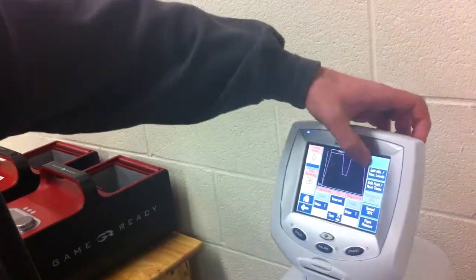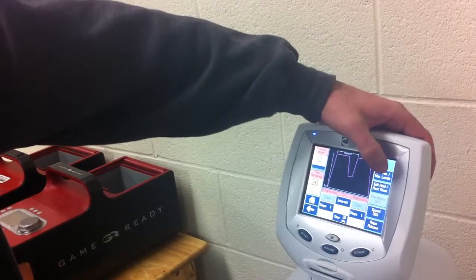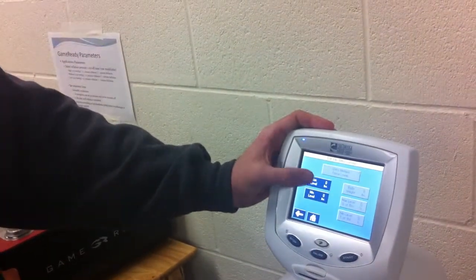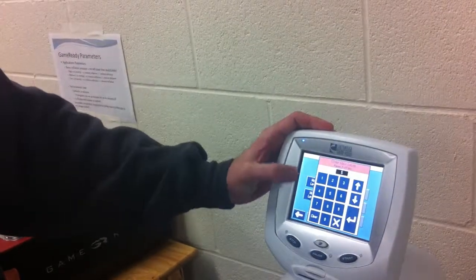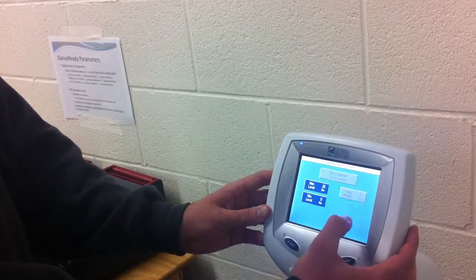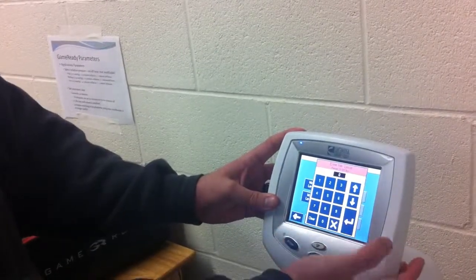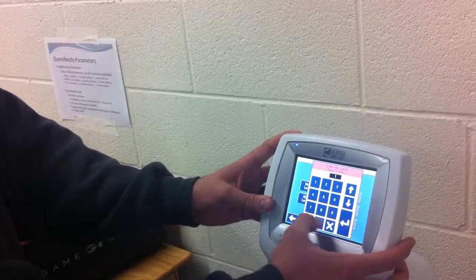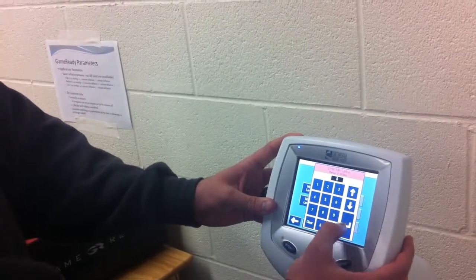Once we get there, we can come up to our edit, our minimum and maximum levels of pounds. For cervical traction, the maximum pounds of pressure that you want is 25. Minimum is 1/3 of that, which would be 8. Like 8, we'll say.